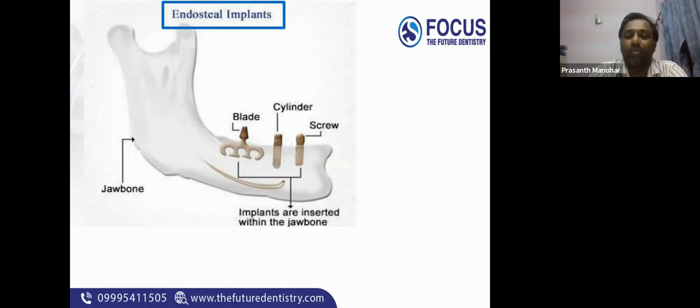Endosseous implants are the commonly used implants. It is placed within the two cortices, that is the buccal or lingual, or the buccal or the palatal cortex, so that it remains submerged in the medullary bone.